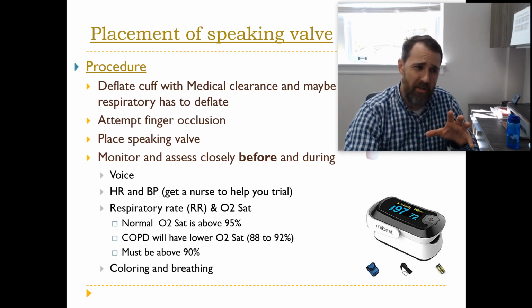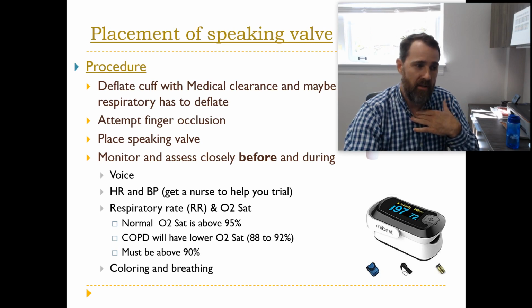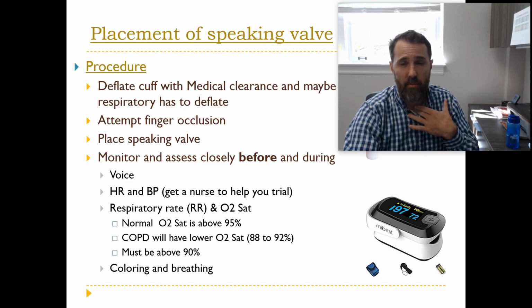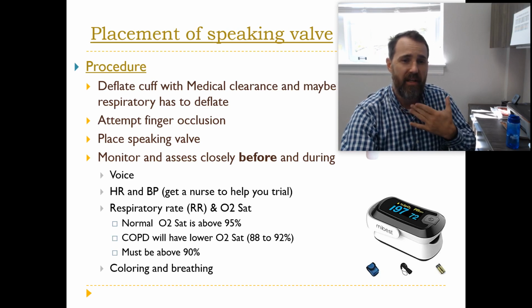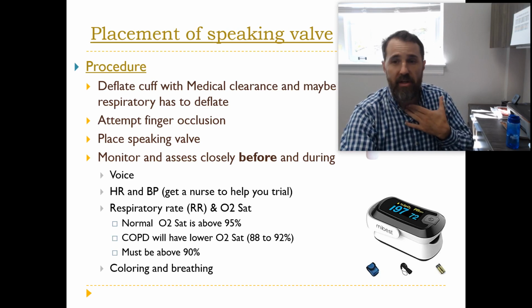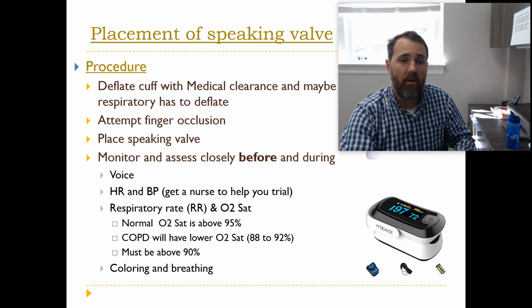Now, this is a touchy situation, and patients are really nervous about this because you are playing with their airway, their ability to take breath, all right? So it's not a relaxed situation for them. They are literally sitting there thinking, I hope this guy doesn't cut off my airway and kill me. So once you get the patient to where you have found that they can tolerate the finger occlusion for a period of time, they're good with that, then the next step is putting the speaking valve on and seeing if they can tolerate that for how long.